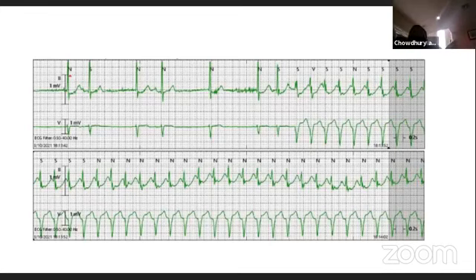First of all, we did not see any AFib that is in the patient's chart, and the patient was given Eliquis. So I always tell the fellows to look at all the data before you commit to anything, and don't believe anyone, just believe yourself, and look at the echo yourself, not the report. So we are doing our own echoes and we are looking at this.